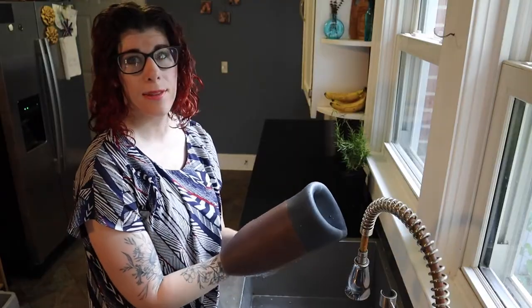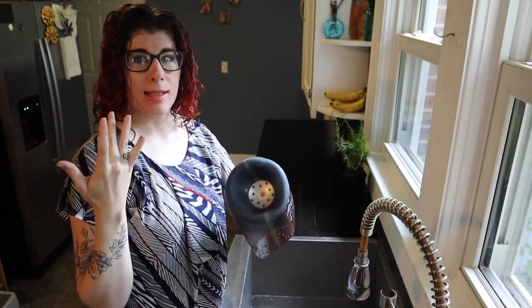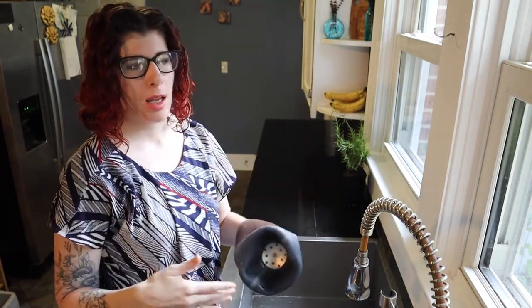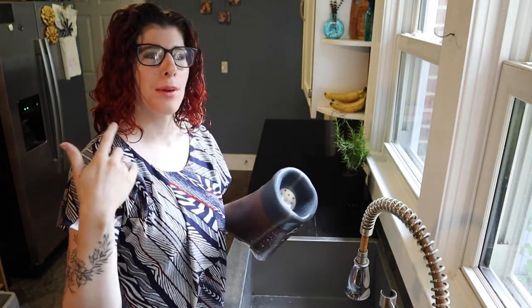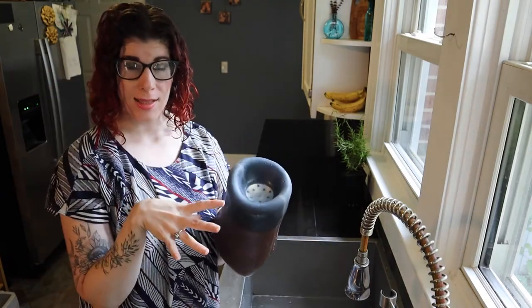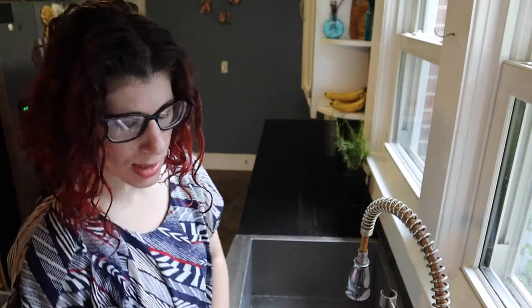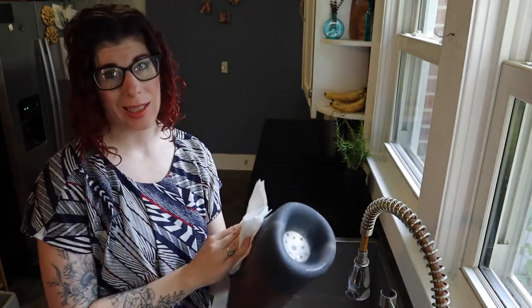So now that the liner is washed, how do we dry it? Some liners do come with a stand — you just turn it right side out and set it on the stand. If you don't have one of those, you can use a broom handle, a wine bottle, a paper towel holder, anything like that. Typically though, I recommend turning it back right side out and laying it flat on the counter to dry.